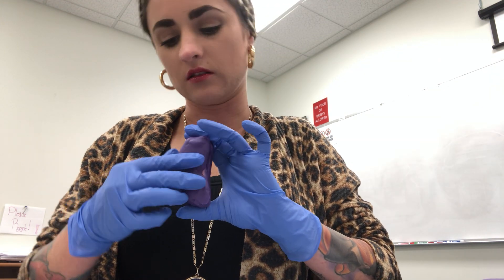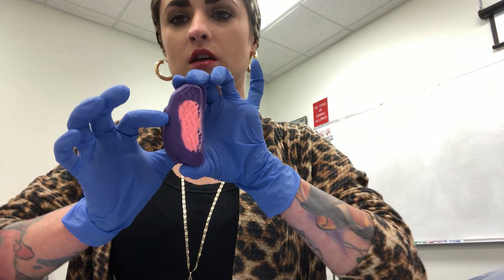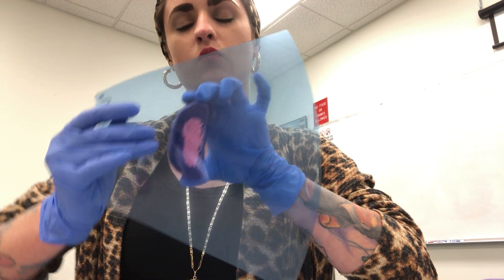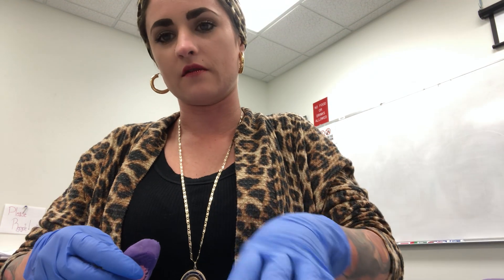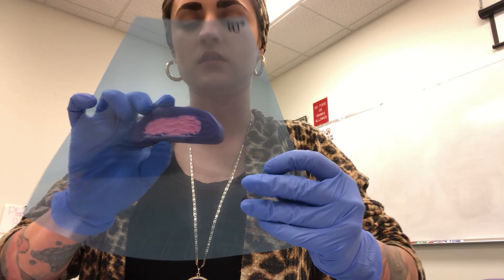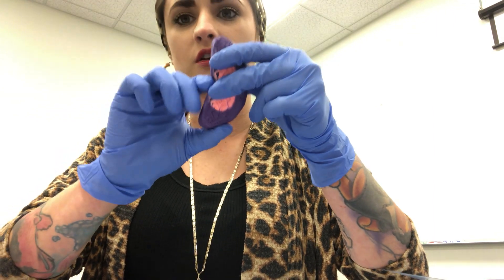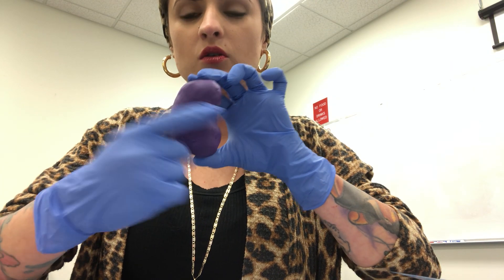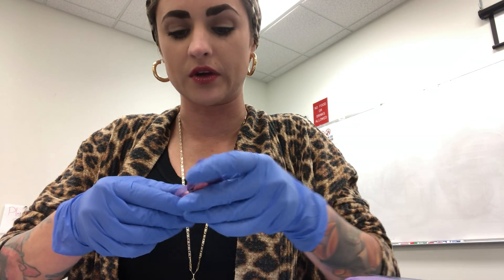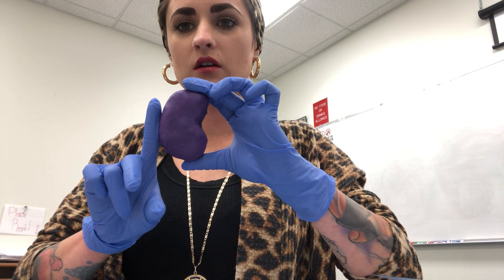Coming from coronal, we'll take off that anterior portion and then look at the coronal mid cut. We're going to come through coronally and what we'll have is a nice big mid cut going from lateral to medial, with the superior and inferior aspects visible. On the screen it's going to be very similar to the mid cut from the anterior-to-posterior approach. You're going to have a little bit of a concave portion - we're chopping it right down the middle, so the image will be a little concave. The goal of the mid cut is to get it as long as possible, right in the middle of that organ.